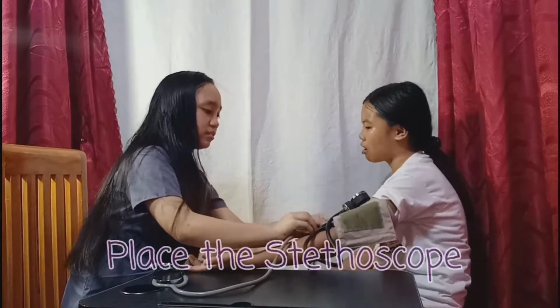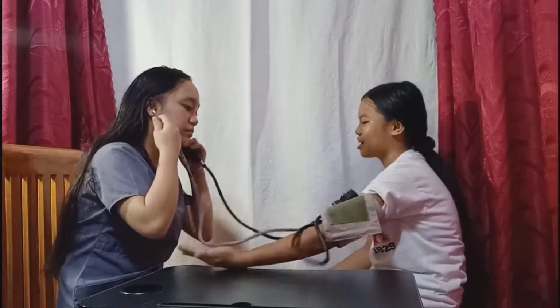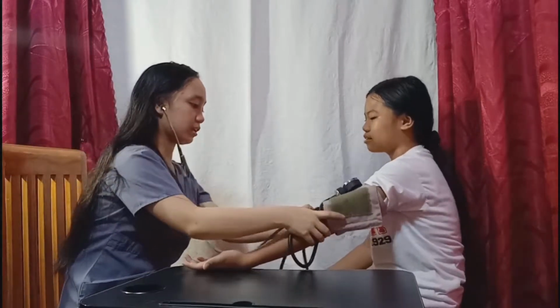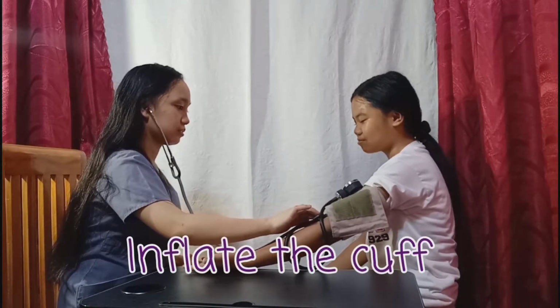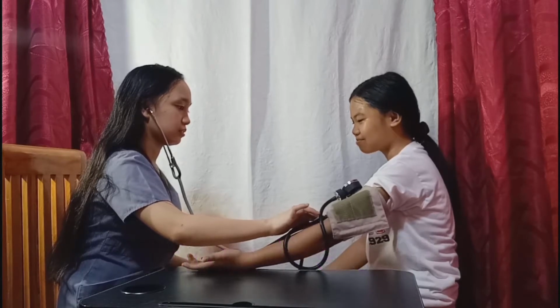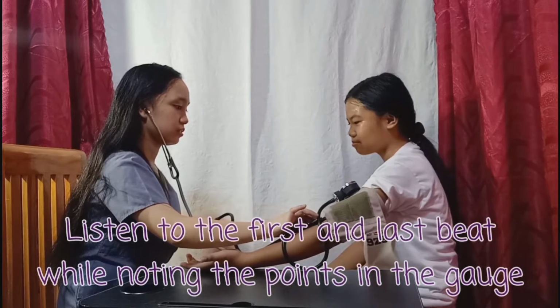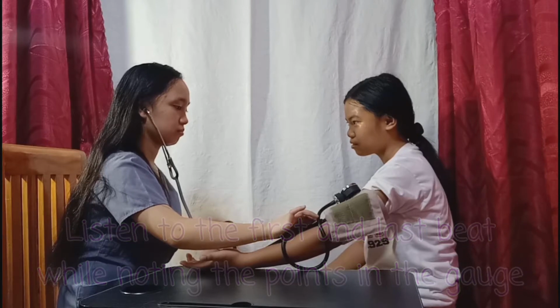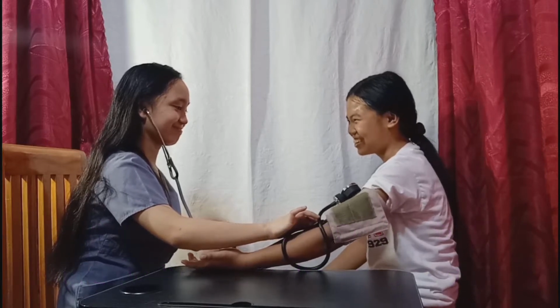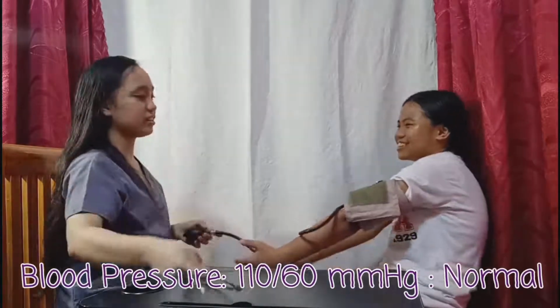Take your stethoscope and place the diaphragm on the artery, in between the 2 tubes. Inflate the cuff to 130. As the arrow falls, listen to the first beat, which is the systolic, and the last beat, which is the diastolic. Take note of the points where these 2 sounds are heard at the gauge. The blood pressure is 110/60, which is a normal blood pressure.